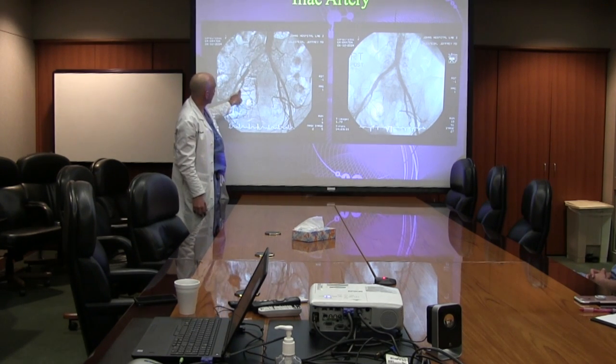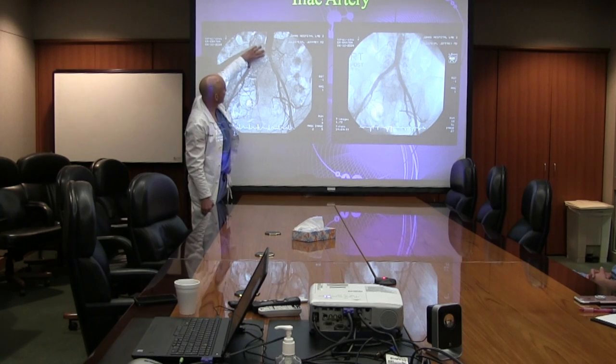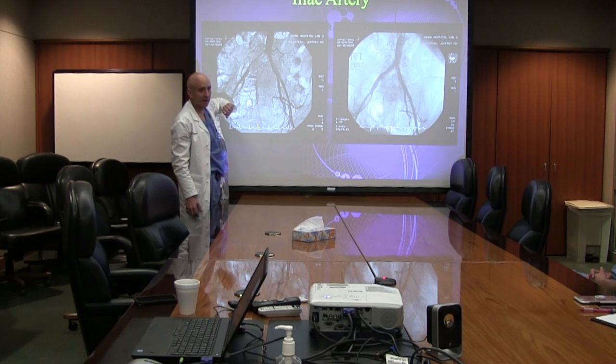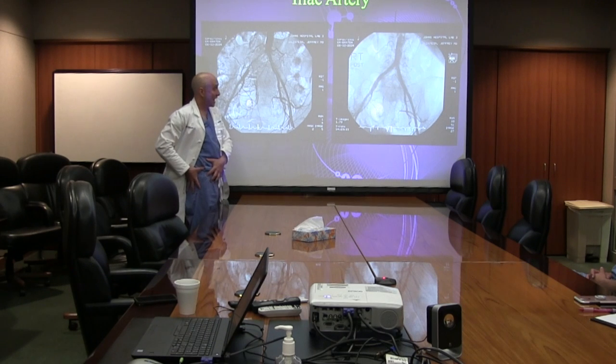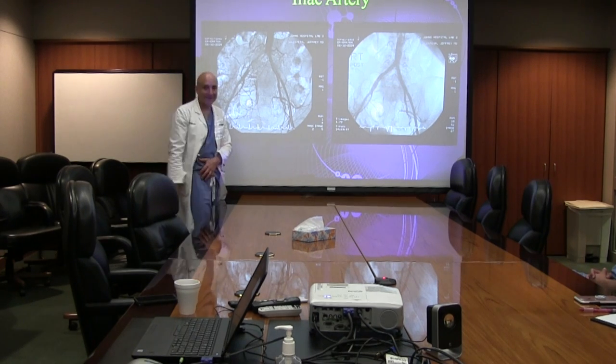So this is the right internal. Another name for the internal iliac artery is the hypogastric. This is the external. So this is a patient with a right common iliac stenosis. Where would you think their claudication would be? Buttock or hip pain. Yeah, these guys may come in, and we see it several times a year where patients have had hip replacement, and they actually have this problem.